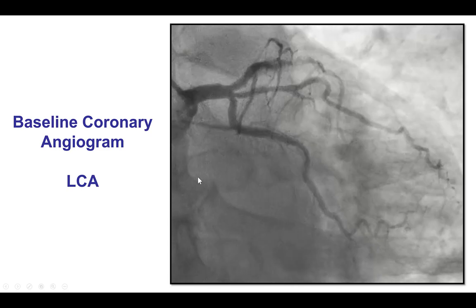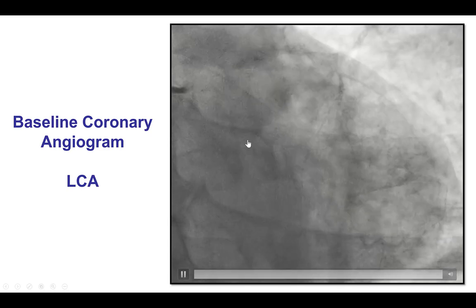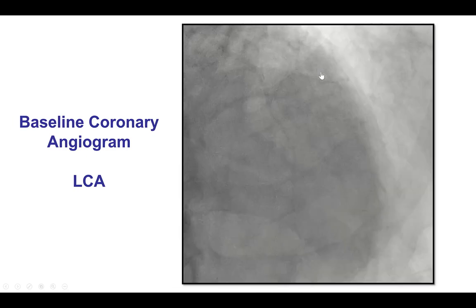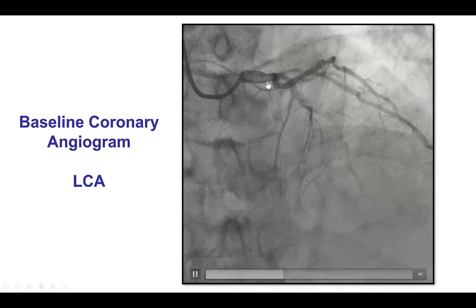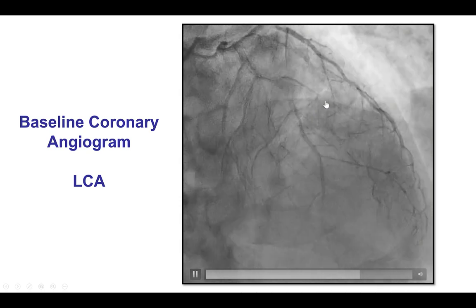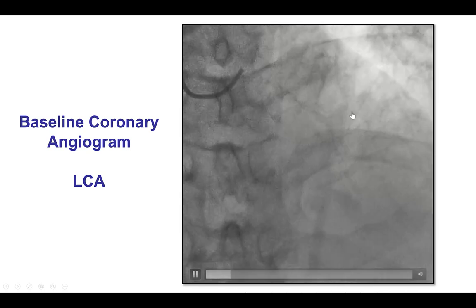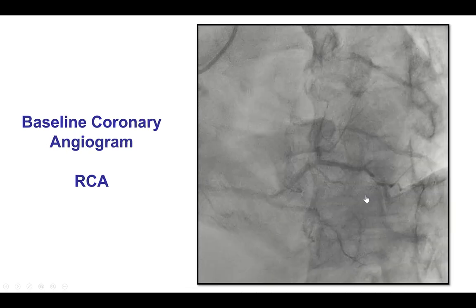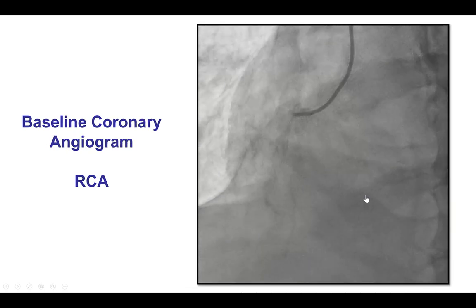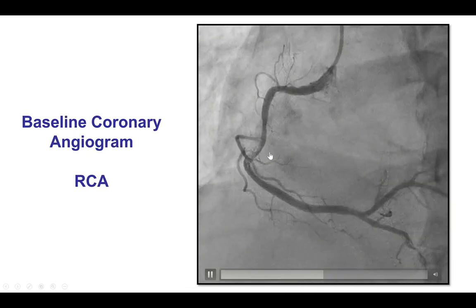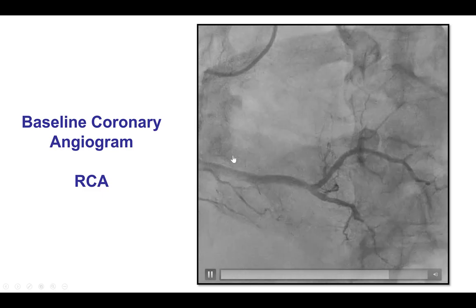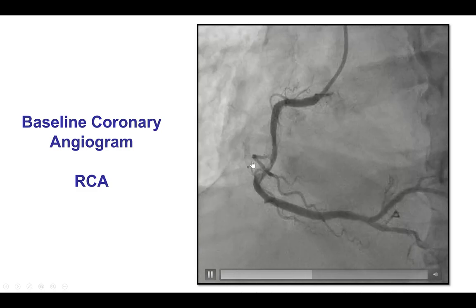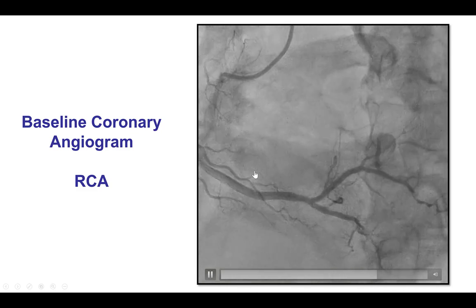Coronary angiography showed no significant disease in the circumflex. However, the LAD was occluded with significant calcification. This appeared to be a chronic total occlusion with distal filling via ipsilateral epicardial collaterals. The right coronary artery had significant calcification and did have a lesion in the mid-segment, along with an intraluminal filling defect that likely represented thrombus.